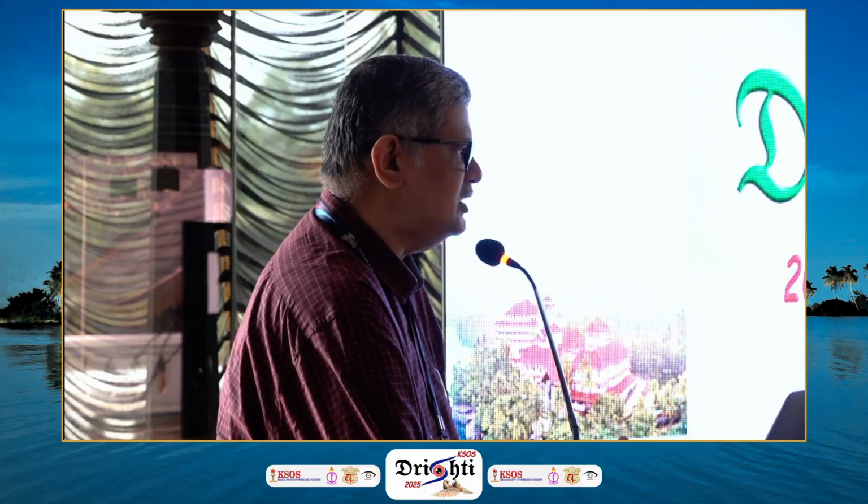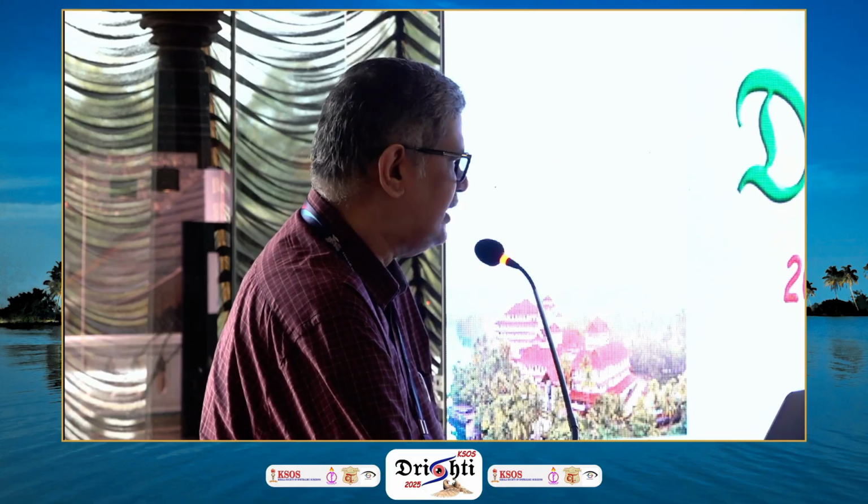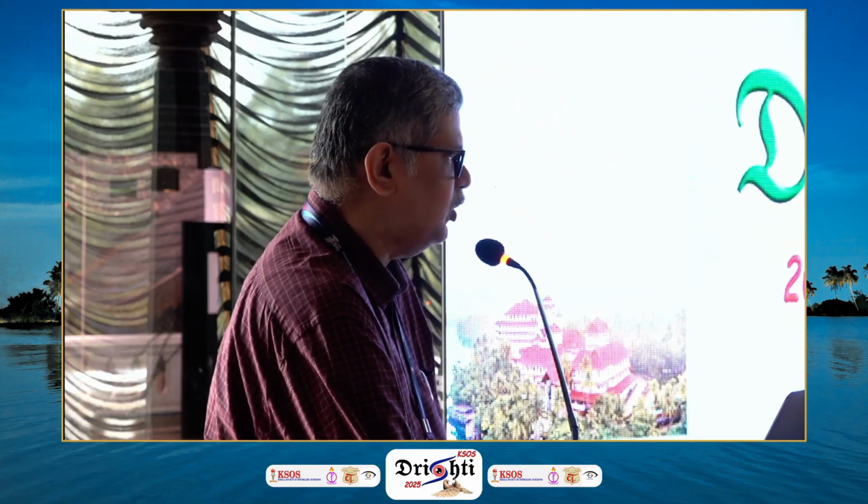And there are also surgeons who are very fond of monovision. I don't know how many of our surgeons are using a lot of monovision lenses, but that is also another possibility with all these, especially for outdoor people who just don't want to wear glasses. Correct one for distance, one for near. If the reading habits are not too high or too long, they can still use monovision.